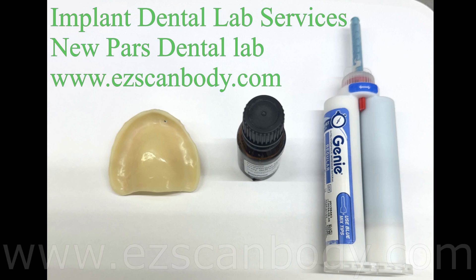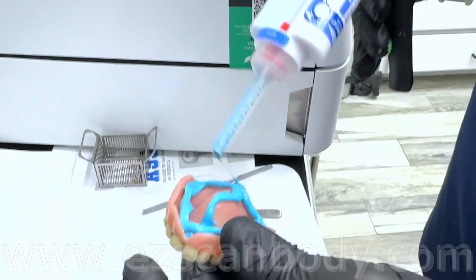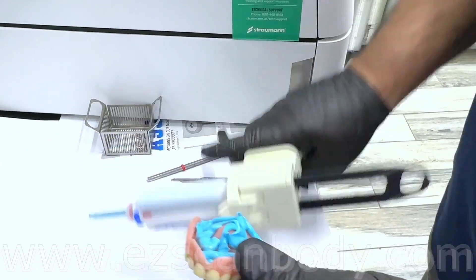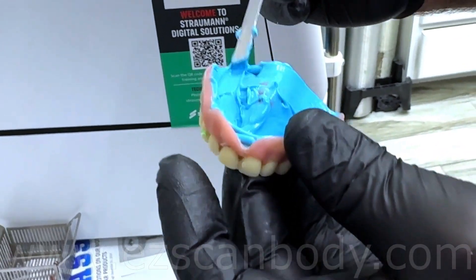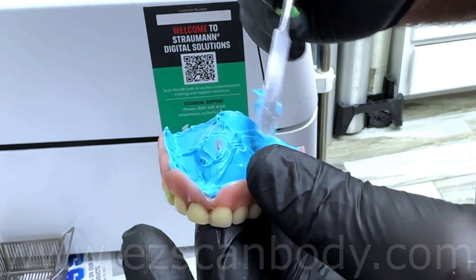To start, we need to reline the denture and use it as a special tray and bite block at the same time. Use adhesive to make sure the impression material won't come off from the denture. Spread the impression material evenly and make sure to cover all the borders. If there is no space between the gum and denture, you can use light body impression material.